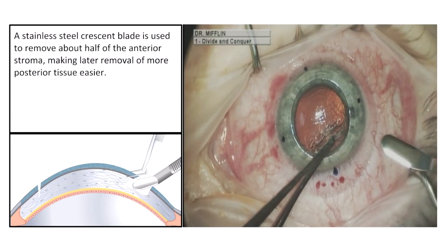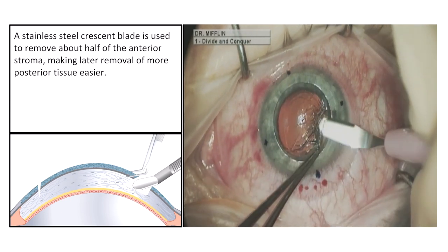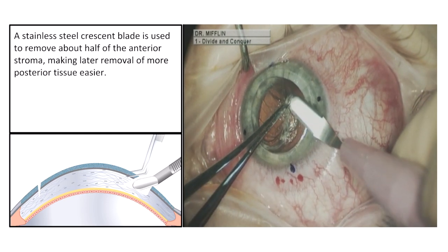A stainless steel crescent blade is used to remove about half of the anterior stroma, making later removal of more posterior tissue easier.